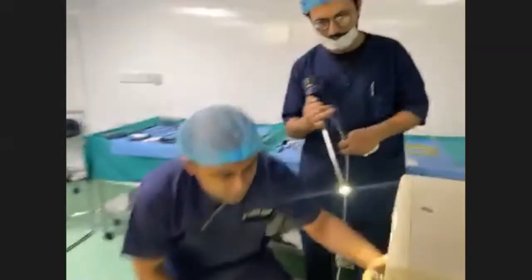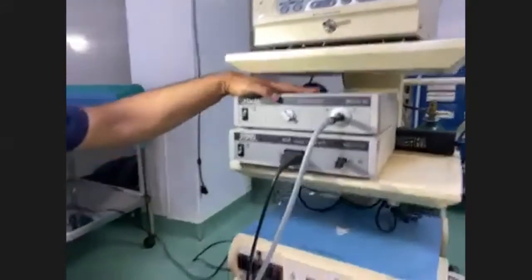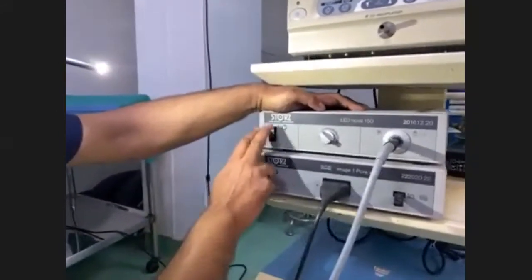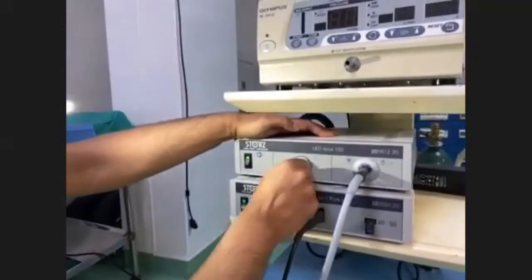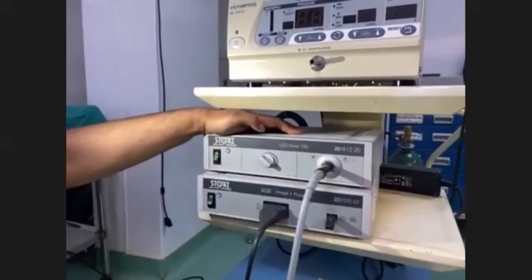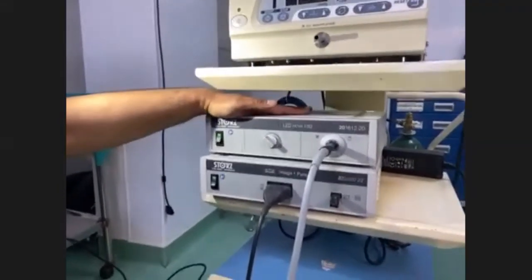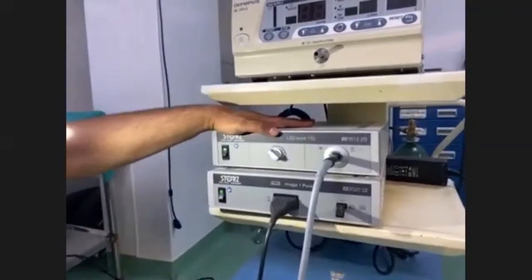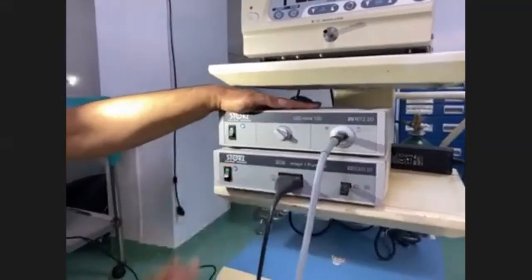Come on the front side. If we see a little of this light source, here you can see that it has got a switch on and off button. Here is a button to control the intensity of light, a knob-like thing. And there is a port where you can insert the light source cable in. This is basically an LED light source, but on the other hand, there can be xenon light sources as well. So this is a CCU or camera head unit.